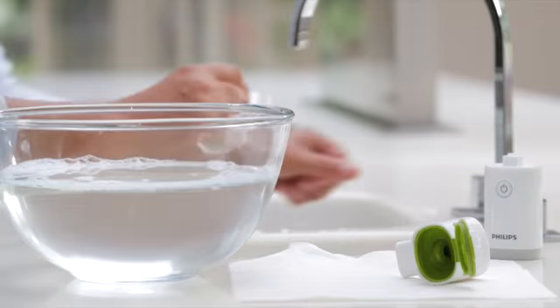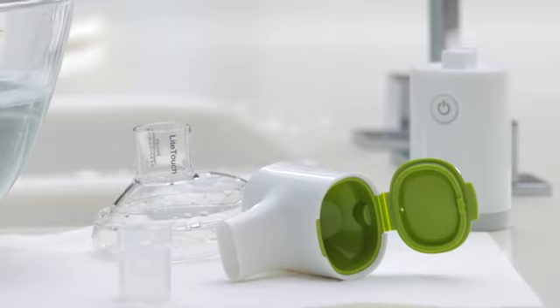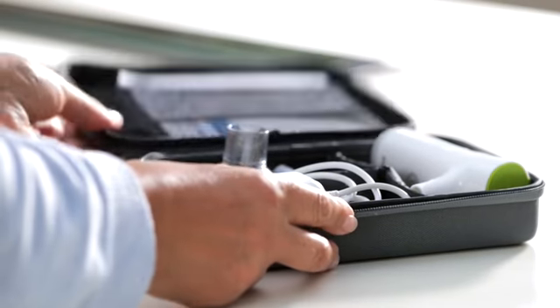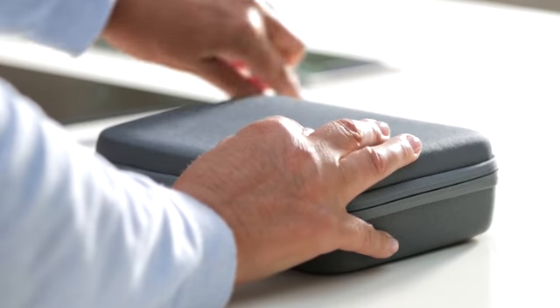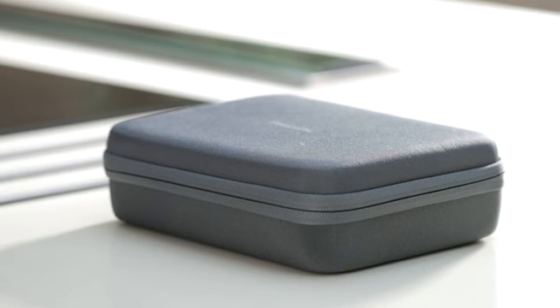To ensure you receive the best possible treatment from your Inaspire Go, you should replace the mouthpiece every twelve months. When you're not using your Inaspire Go, store it in its original case to protect it. We hope you've found this video useful. If you need any further help or advice about Inaspire Go, please contact your retailer or call Philips Customer Service on 1 724 387 4000.